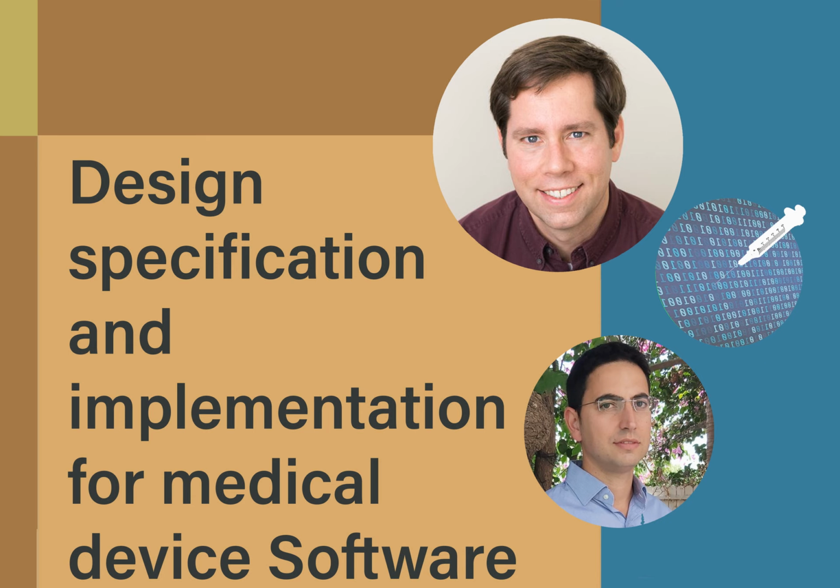So when we talk about design controls, design in that context is referring to the overall design of your medical device, and essentially a way to verify that design meets the intended use and the user needs of whatever healthcare worker or patient is going to be using that device at the end. So when we talk about the design control process, that's the level of design we're talking about, the design of your device overall.